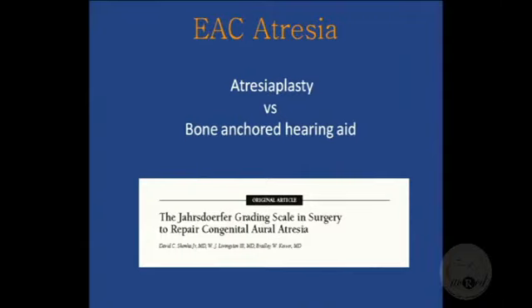You can follow any scoring system, but you have to be consistent, or you need to know your surgeons and they need to say, okay, this is what we follow, I want you to give me the scoring based on these criteria. It doesn't have to be this scoring system; there are various others. I just wanted you to know that there is a scoring system, and we have to report CT temporal bone in patients with external auditory canal atresia based on it.